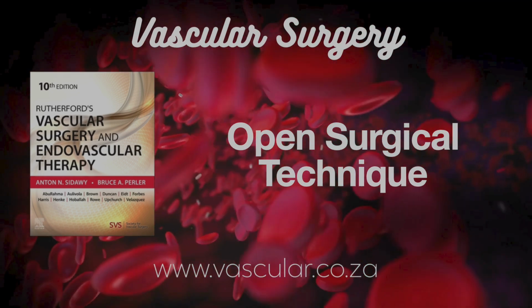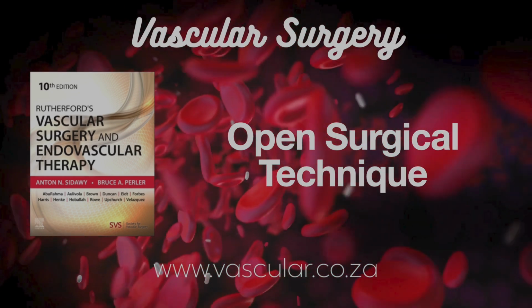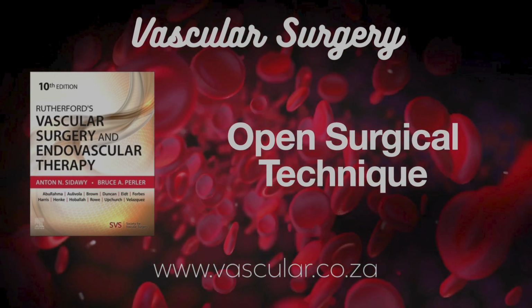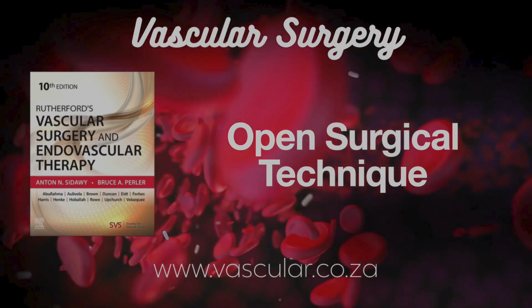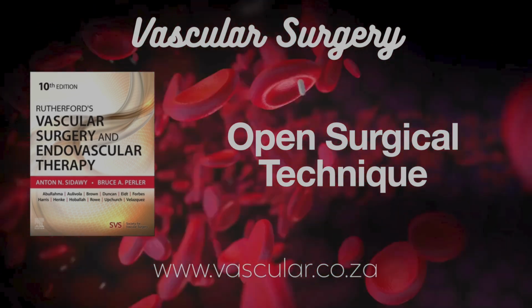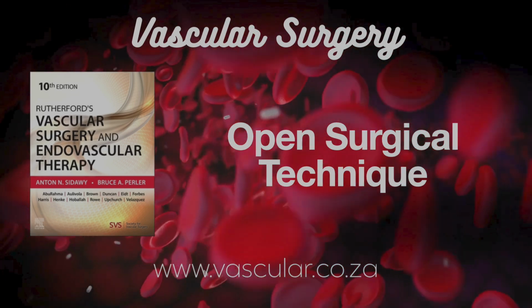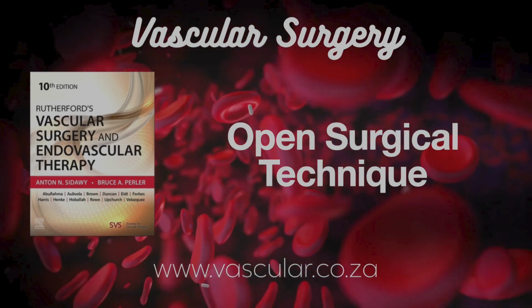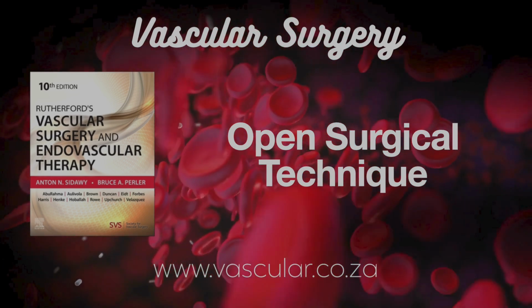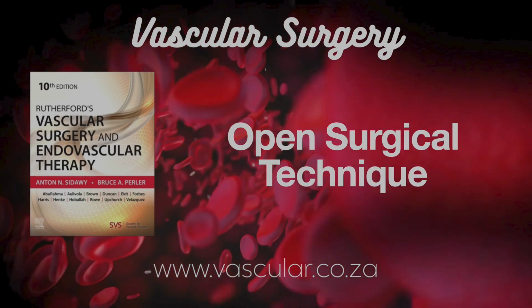Okay. Let's take clamps, for instance. What's special about them? Well, vascular clamps have very fine ridges, serrations, on the inside. To grip the vessel securely but gently, the goal is to minimize the risk of crush injury. But there is a risk, right? You mentioned damage. Absolutely. There's a risk of damaging the inner lining, the intima, or even tearing the vessel if a clamp isn't put on correctly, especially if there's plaque present or if you use too much force. That's why surgeons often feel the artery first, palpate it, to get a sense of where any plaque buildup is oriented.